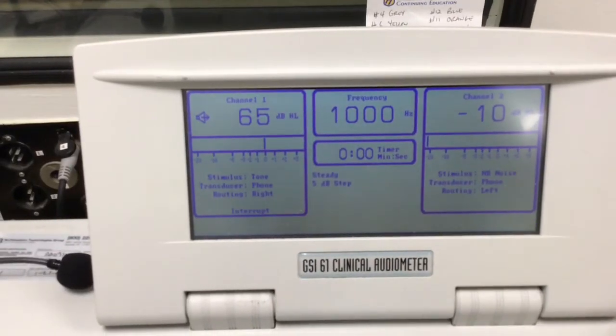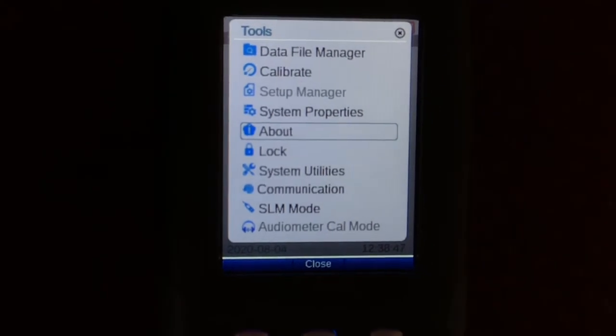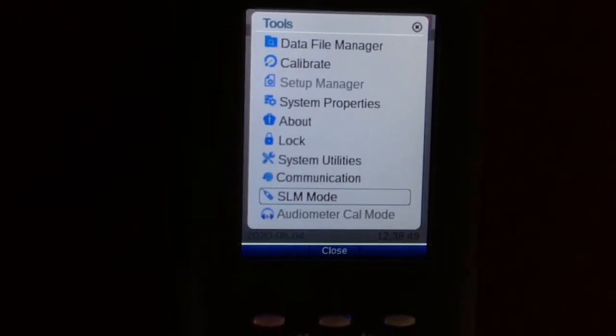Here I am just setting up the audiometer. It is set up at 1000 Hz at 65 dBs. We are just ensuring that what I have here is being accurately produced by the headphones. And with the SLM, I'm just verifying that it is in audiometer calibration mode, which it is — all the way at the bottom.